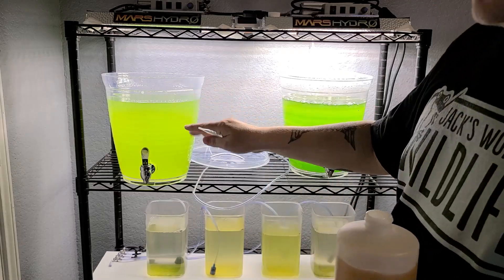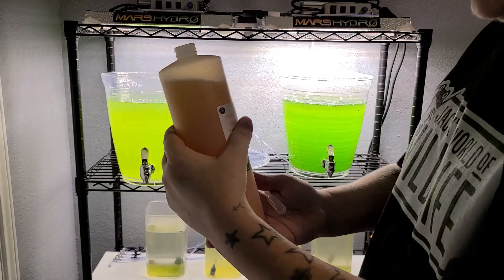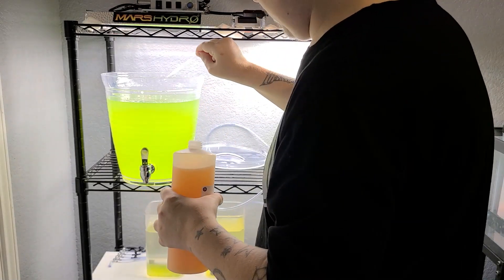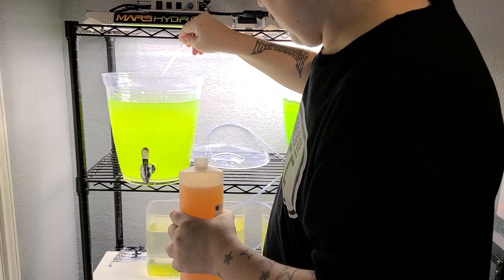For this size container — about two to two and a half gallons — I like to add six milliliters of Mercer Montana's F2. I find that gives the best results for me. So that's three milliliters... and six.